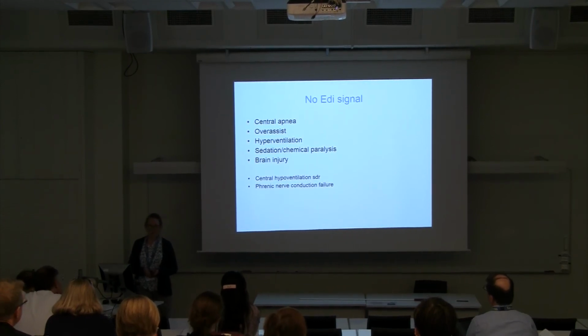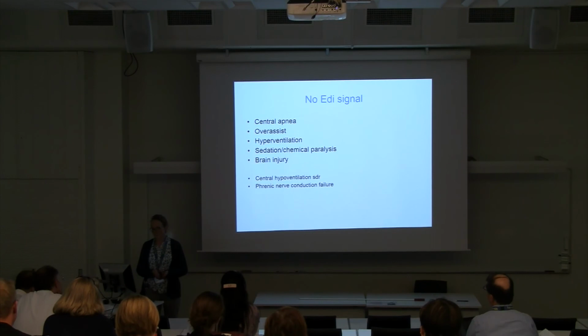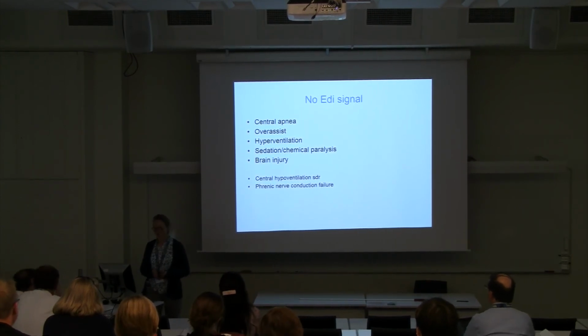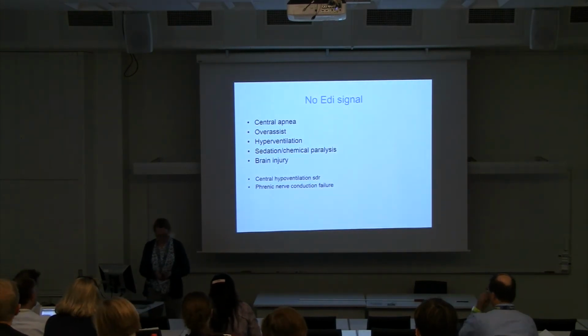And we can also use the EDI signal to diagnose brain injury. And the EDI signal has been used to diagnose central hypoventilation syndrome and also phrenic nerve conduction failure.